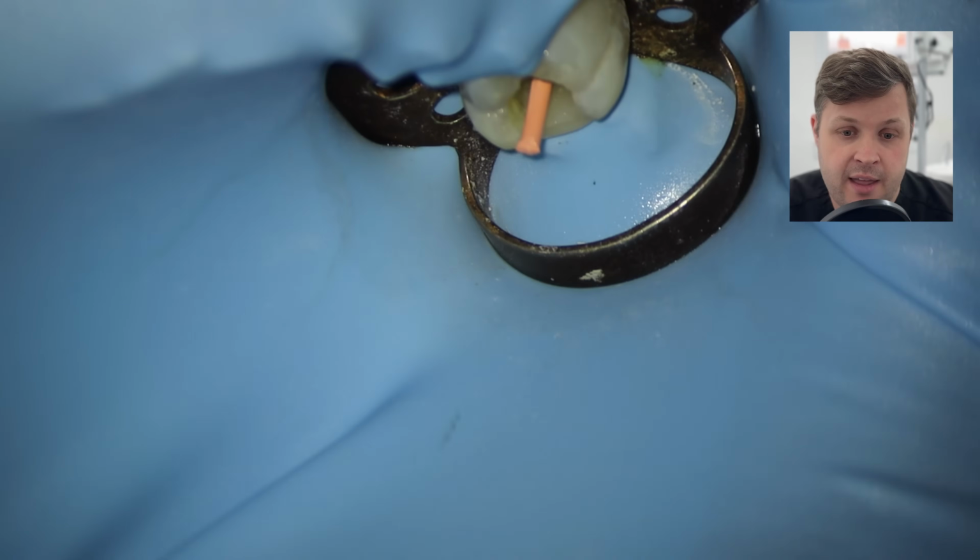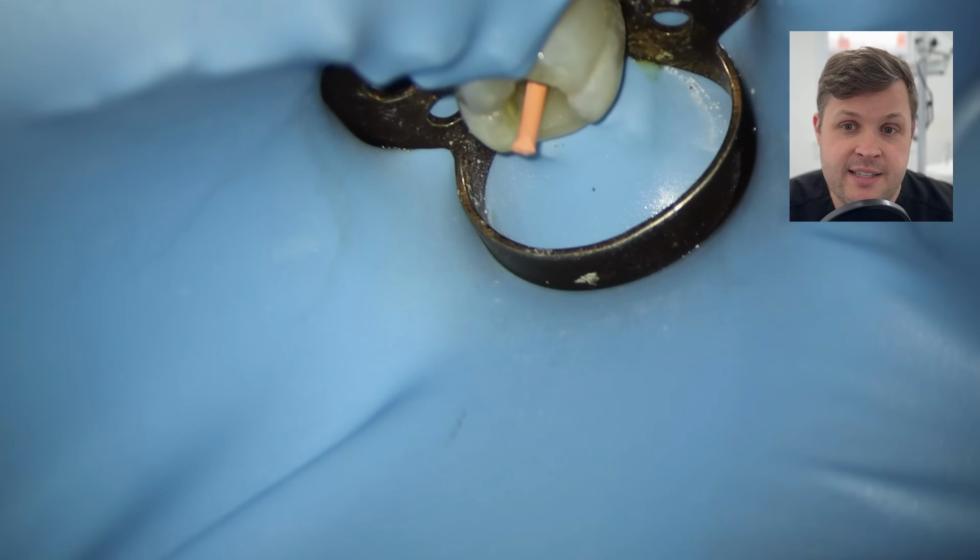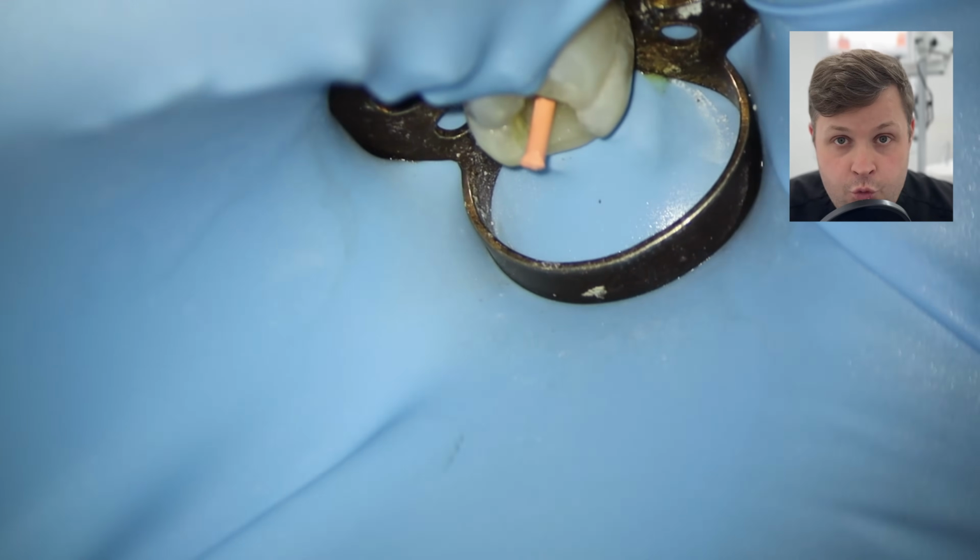So in this case, what we've done is we've highlighted a possible issue. We think that the distal canal working length is incorrect. We've rechecked the working length many times. We've reshaped the tooth, and then as we place the GP cone to the correct length, as from the apex locator, it's still looking like it's a bit far away.